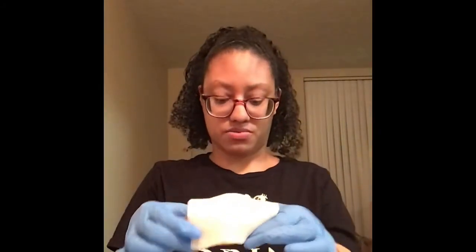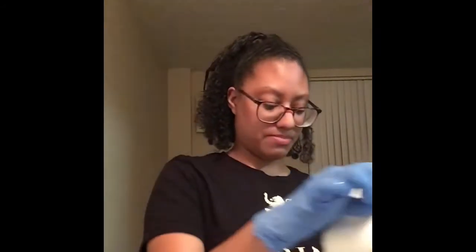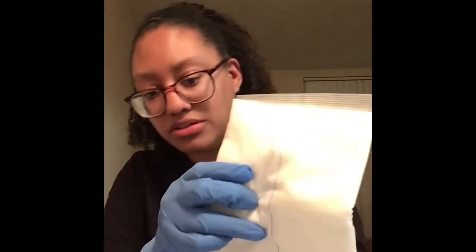Now that we have packed the wound, we are going to grab a 4x4, place it on our wound, and we are going to grab our ABD pad and place that on the wound with the blue line facing up. I don't know if you can see that. Yep. Now that that is done, the sterile part of the procedure is done, so you can toss everything out.